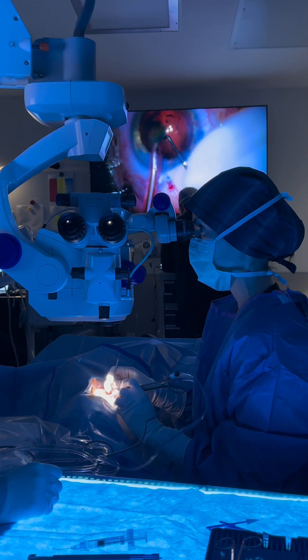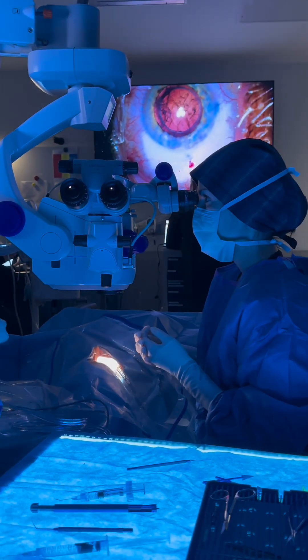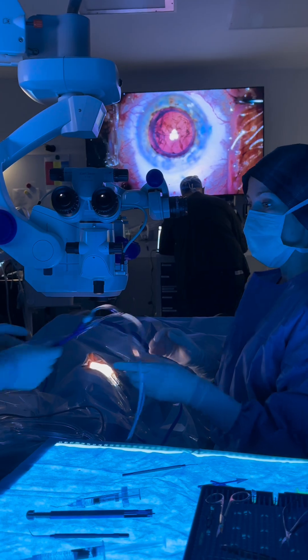Patients are sedated but they're not fully asleep. Sometimes our patients do comment that they see beautiful lights and different kinds of visual experiences during the removal of the cataract.